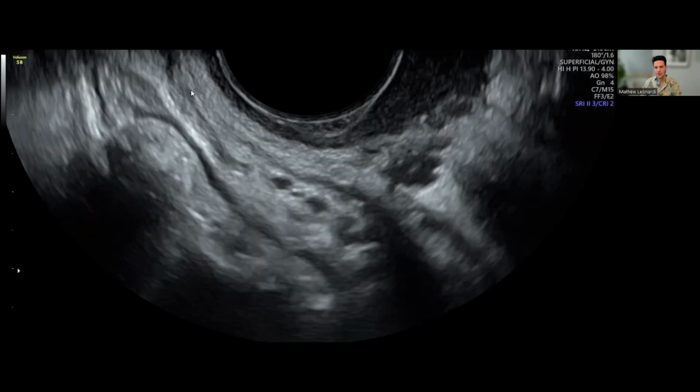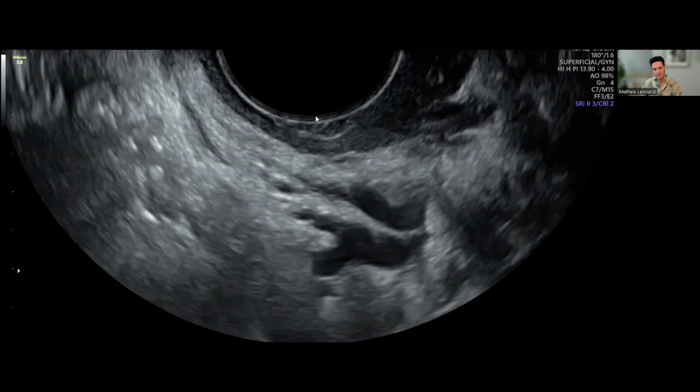And then moving on to the ureters, I can't quite tell you which side this is because I'm not always so good at annotations. I should be, but when things are abnormal, when we're talking about the ureters, definitely there's annotations and measurements. And so we can see this is the path of the ureter right here. This is exactly where it crosses the uterine artery. And when I'm really concerned, I follow it way beyond the level of the crossing, because this is usually where periureteral endometriosis occurs, at that exact level. And so I'll follow this up along the pelvic sidewall.